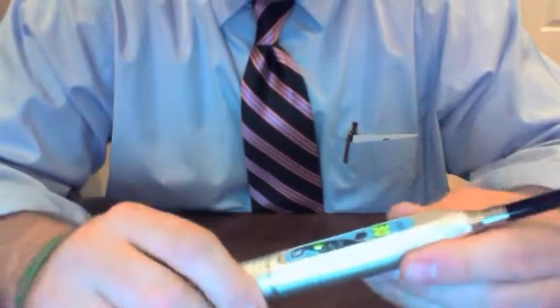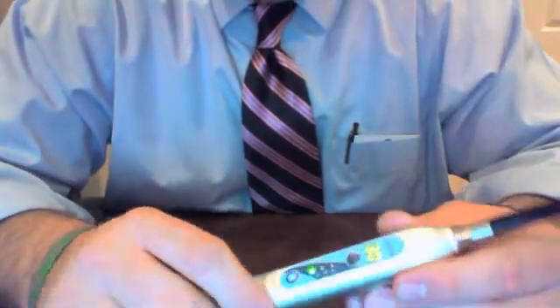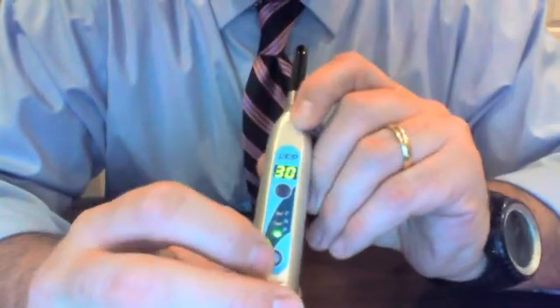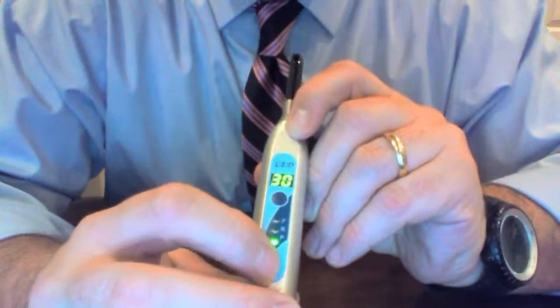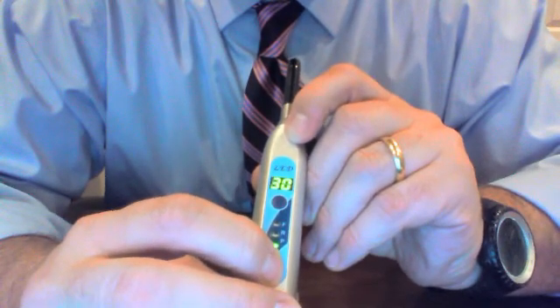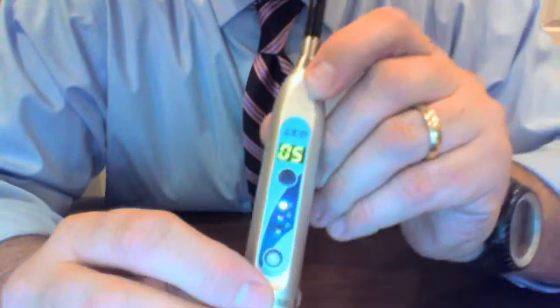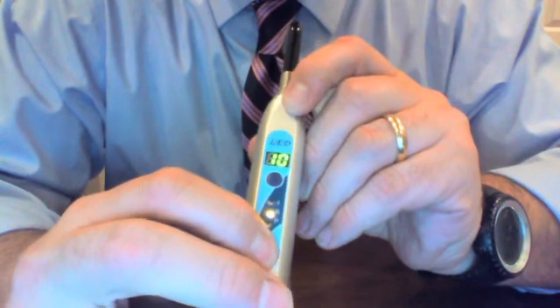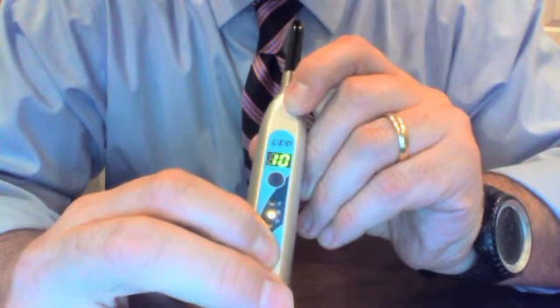I'm going to briefly walk you through the different modes. With the CureFX cure light, to change modes, the bottom toggle button allows you — every three seconds — to switch modes. We're in pulsating mode, so if you hold it down three seconds, it's now in full mode. Hold it down three seconds again, and it switches to ramp mode. Hold it down again and it goes back to pulsating mode.